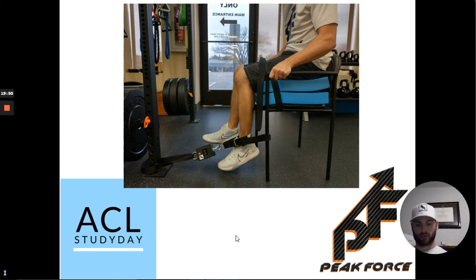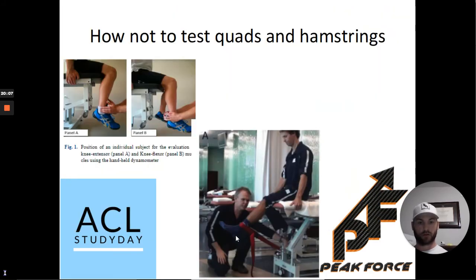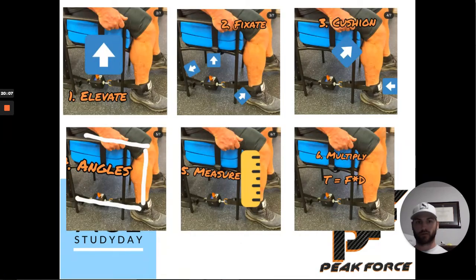I wasn't done with that. Just go back. So the next thing you want to pay attention to is making sure that the test is comfortable, right? So both underneath the knee, if we can get to the right slide. There we go. Making sure that's comfortable underneath the knee and at the ankle, because if it's not comfortable, then the force value you're going to get is not going to be the full capacity of what they can do.